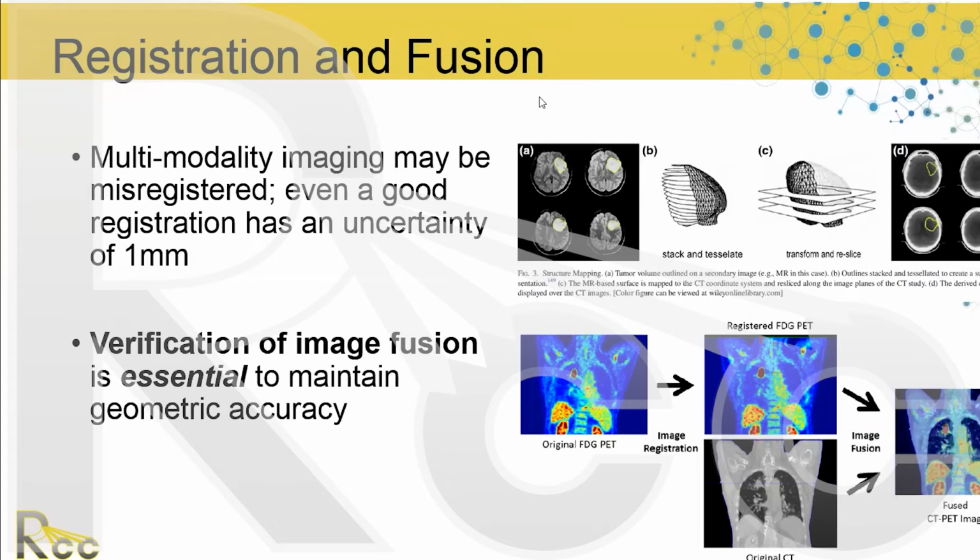My understanding, and I would agree, is that for lung, often using the mean or the average intensity projection is good for matching your cone beam CT. Since your cone beam CT is taken over time, it's going to look the closest to the average or the mean intensity projection out of all of those options.